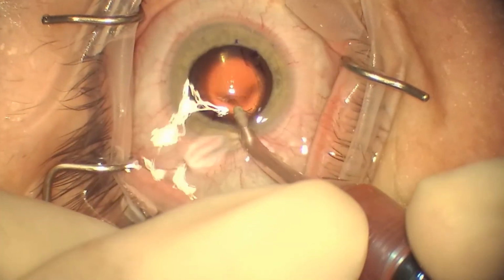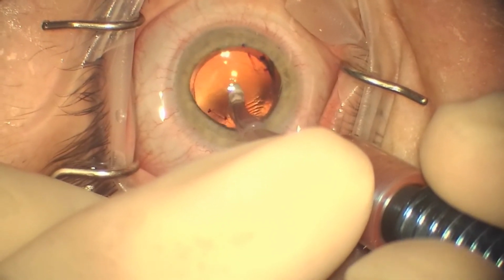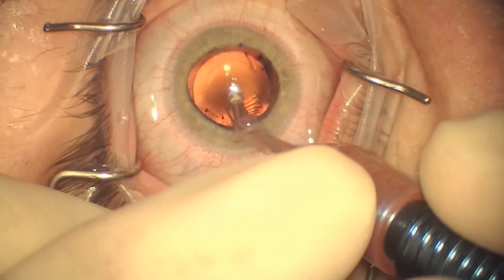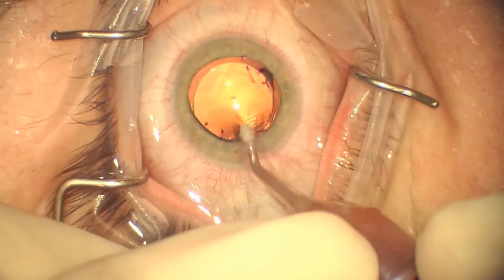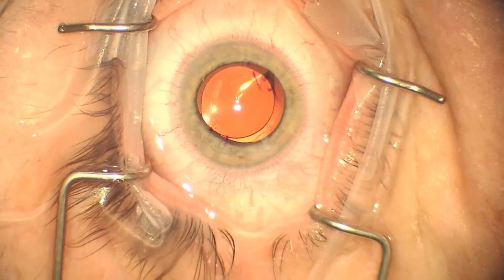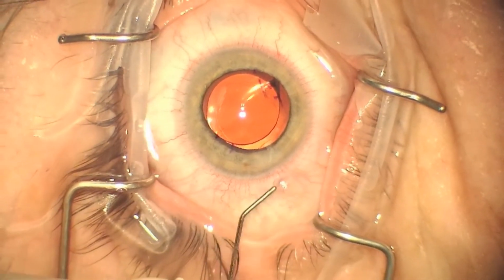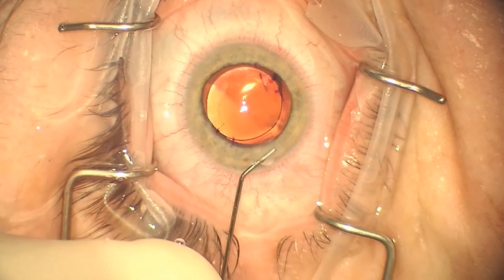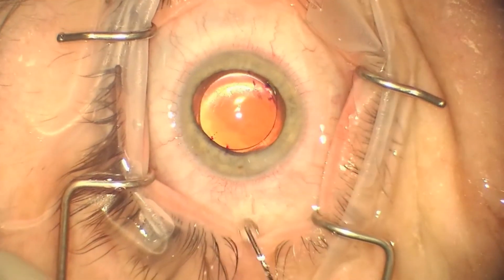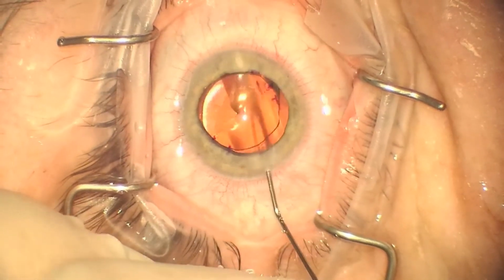Viscoelastic removal is performed with irrigation and aspiration. In this case, I did not put new viscoelastic behind the IOL because the IOL rotated so easily. Once that viscoelastic is removed, the wounds can be hydrated and the centration of the IOL can be confirmed. In this case, you can see that the capsule rhexis is not covering the entire IOL.